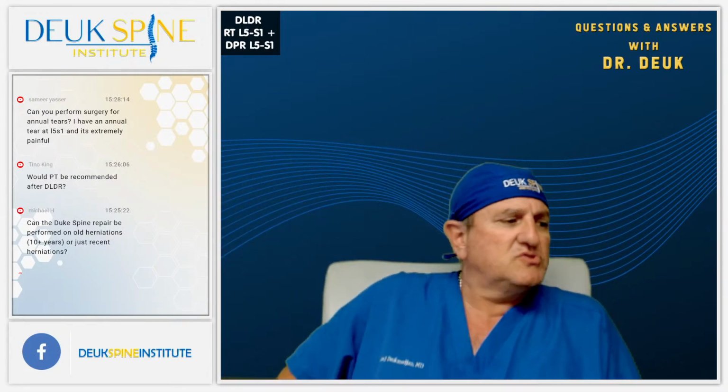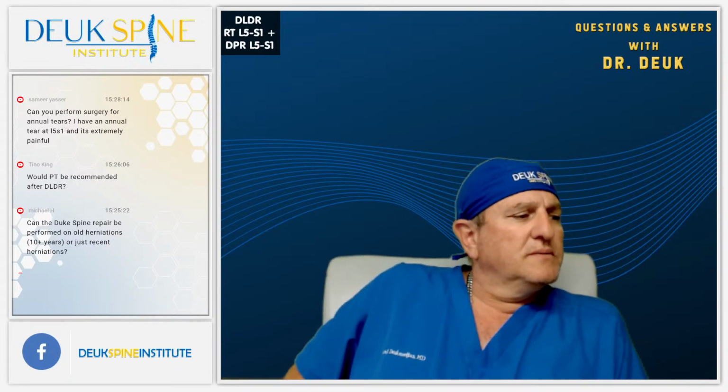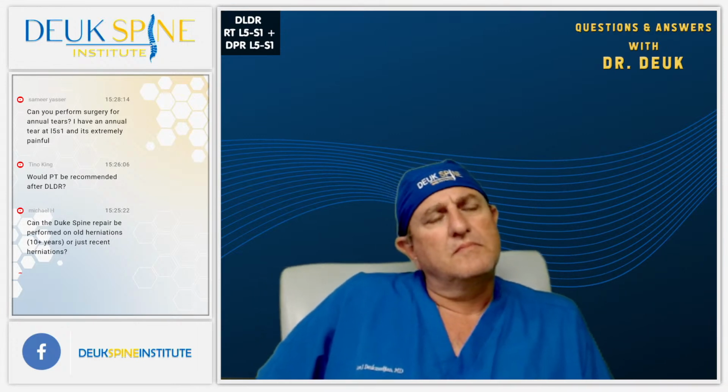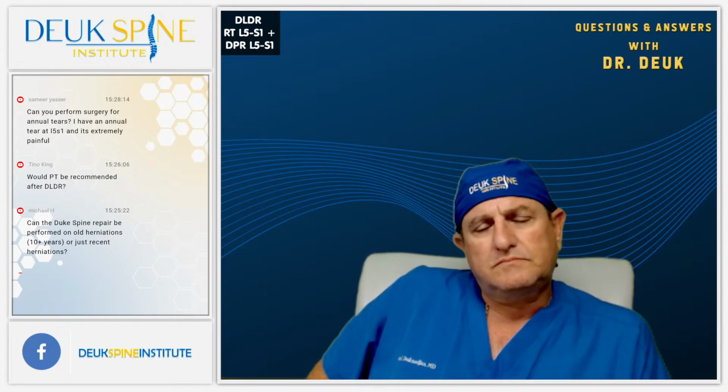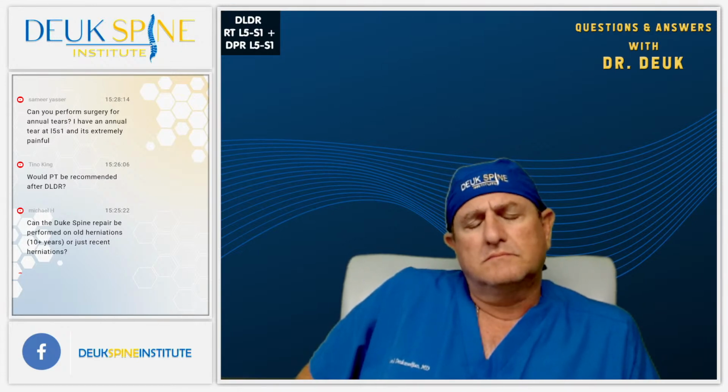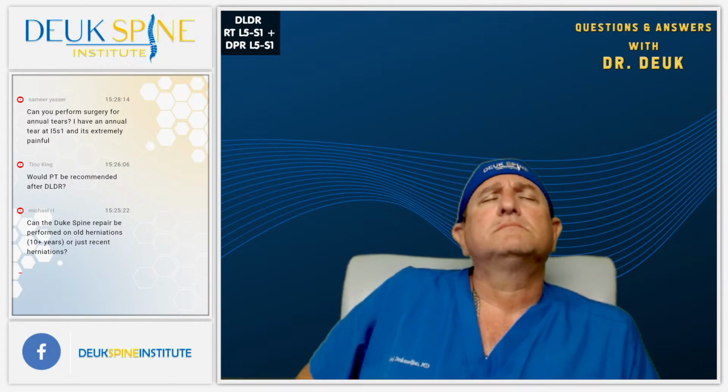All right, any questions? Yes. We currently have 4. This first one comes from Matt on YouTube. And they asked, is it ever a concern while inserting the endoscope to hit a nerve, or while using the laser, is it ever a concern to hit a nerve?